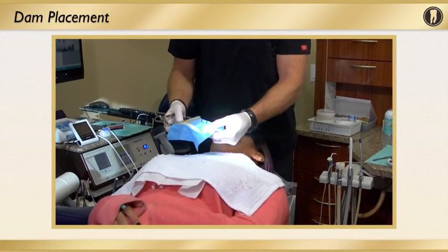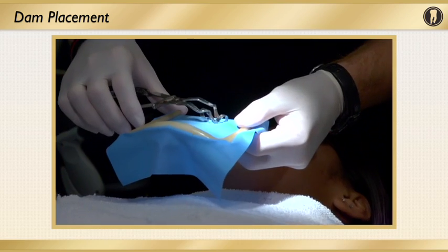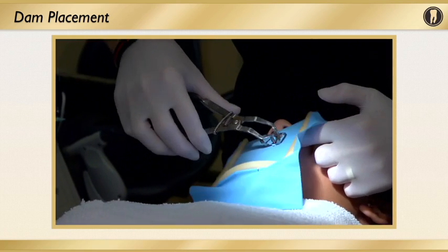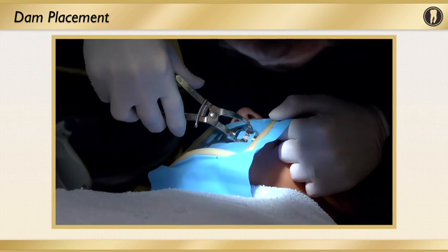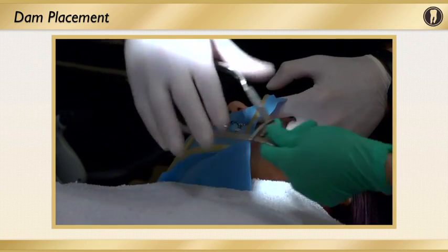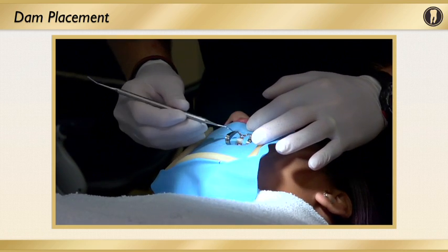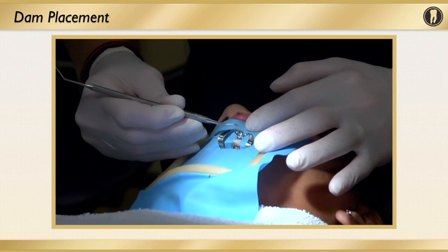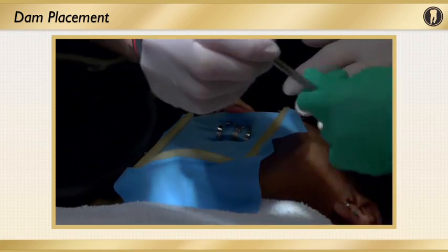Here is a video showing me placing the rubber dam on a patient, and my assistant already punched the hole. It's a maxillary tooth, 1 inch from the top. I have the number 9 clamp already in place in the rubber dam. I'm going to place the clamp and rubber dam all together, and it's very simple to put on. I will put it on, then I will take a Glick instrument, and the back end of the Glick, the hockey stick side, I'll use that to remove the rubber dam off the wings of the number 9 clamp.